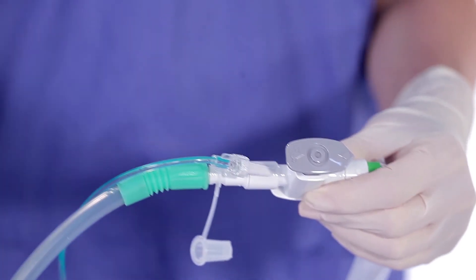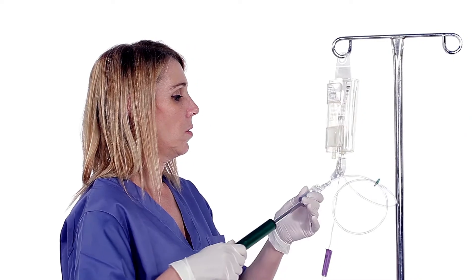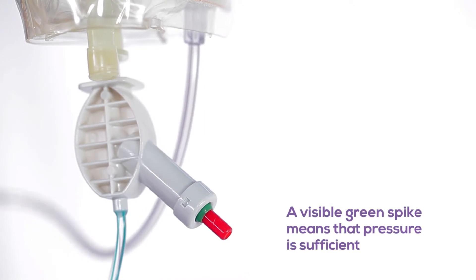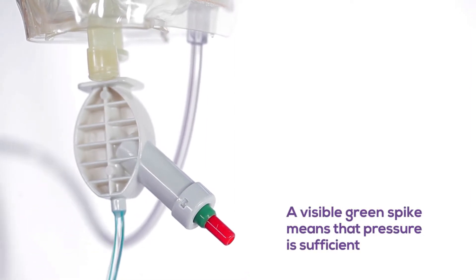Open the roll clamp and prime the set, then connect the extension line to the handle to complete setup.